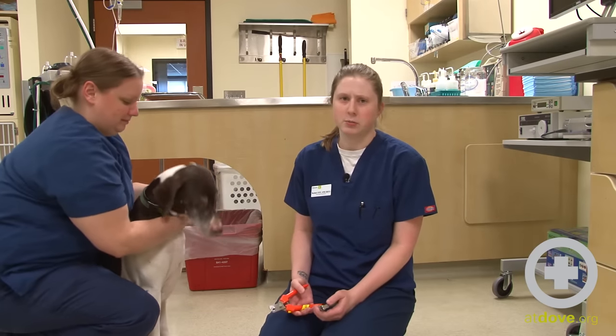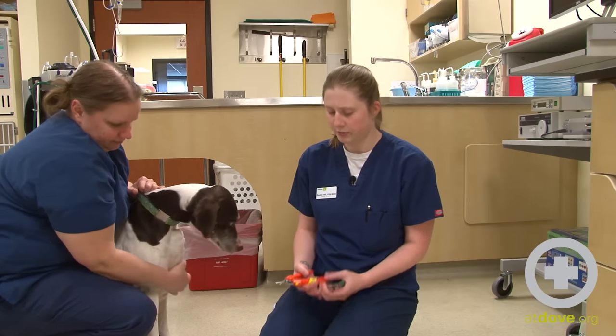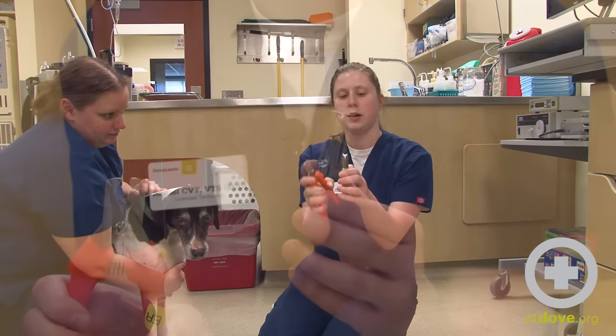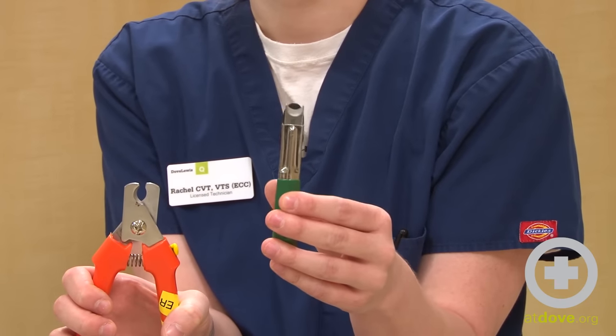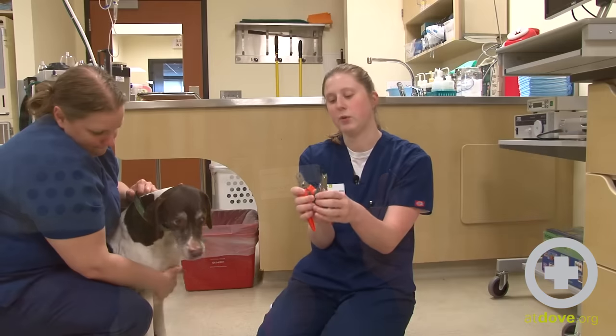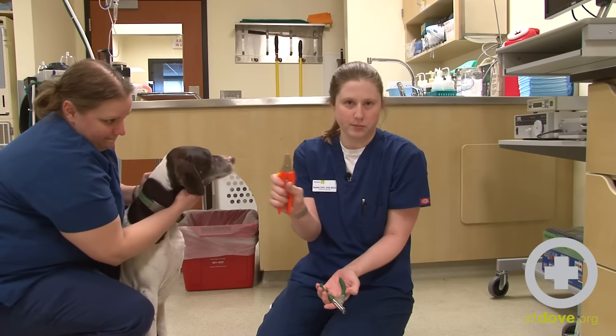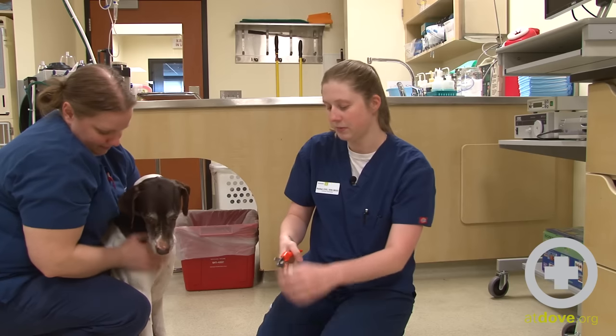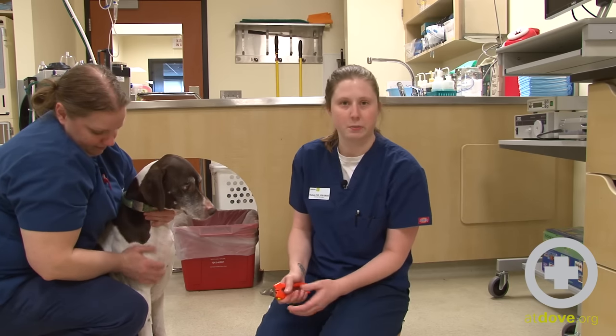There are two main kinds of nail trimmers we use for dogs in the veterinary field. One type comes at each side, and then there's also a more guillotine style where the nail goes in and then it cuts that way. I personally prefer the scissor-style ones as I can see the nail come through a little bit better and can check for the quick better that way.